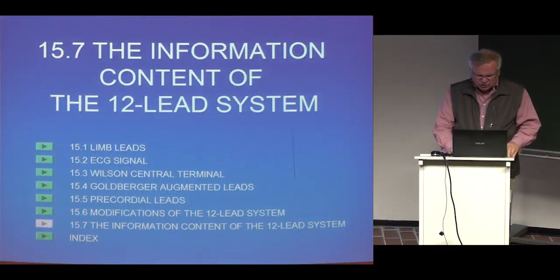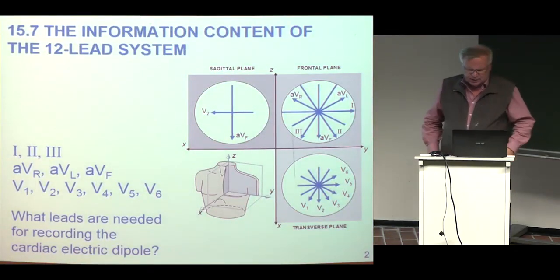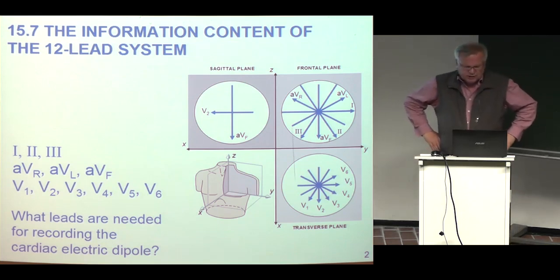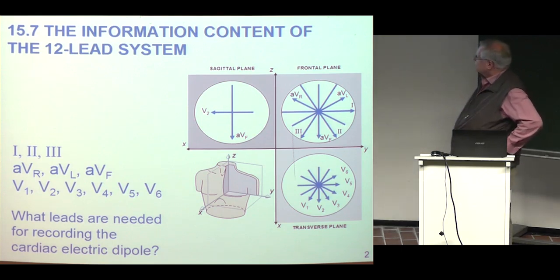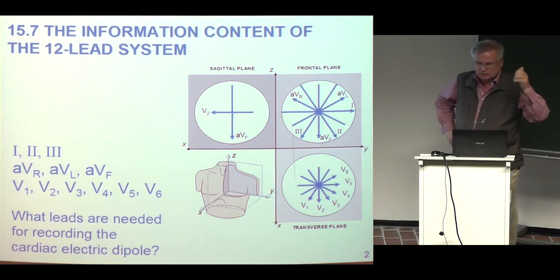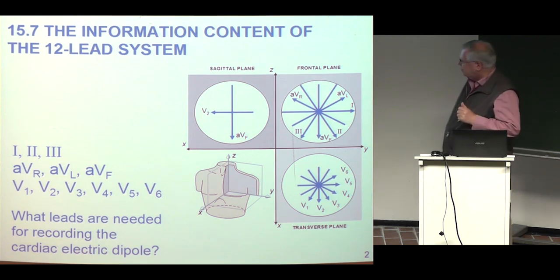The information content of the 12-lead system. I come again to this illustration, and I ask what leads are needed for recording the cardiac electric dipole. What would you suggest? Firstly, how many leads? What's the minimum to record the cardiac electric dipole? How many leads are needed?